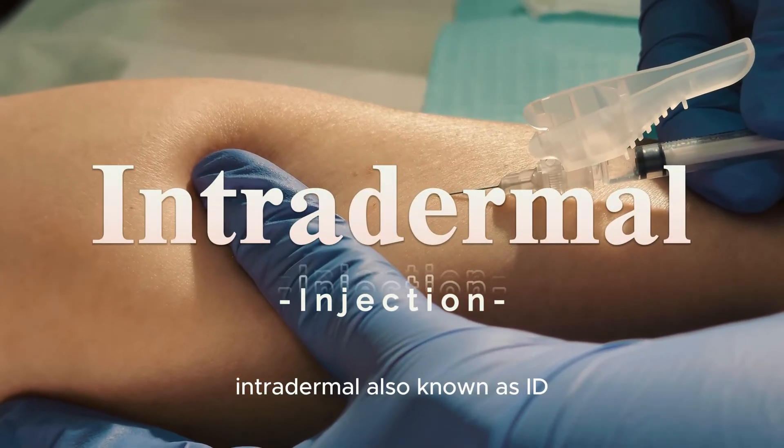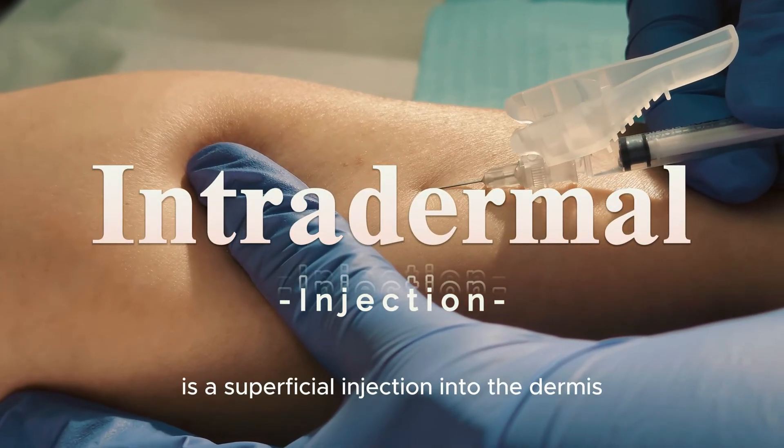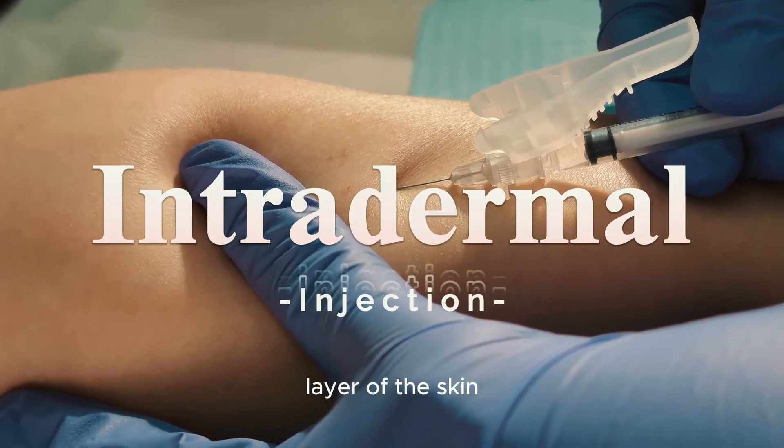Intradermal, also known as ID, is a superficial injection into the dermis layer of the skin.